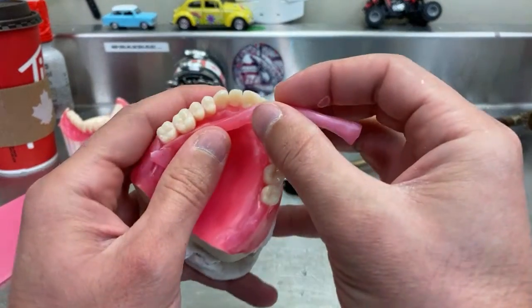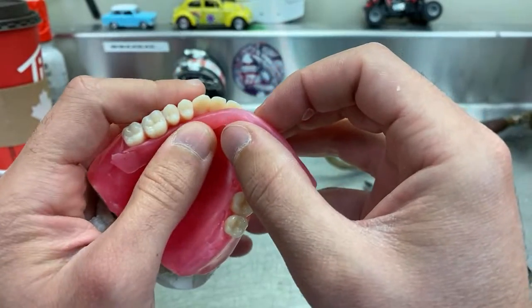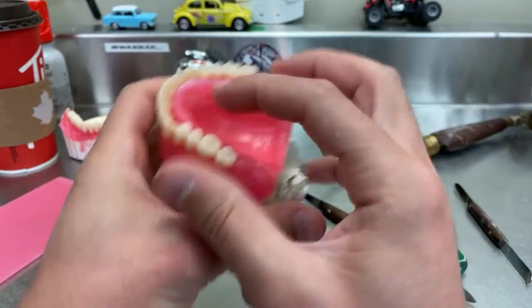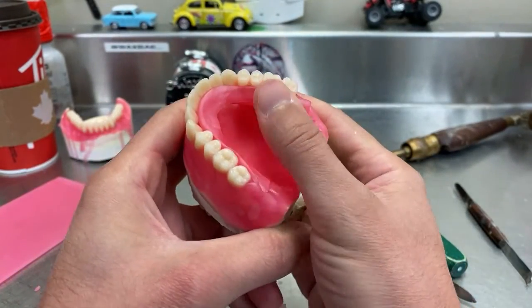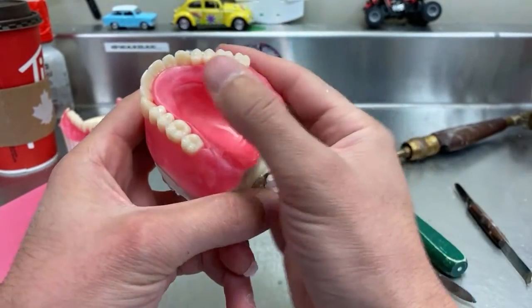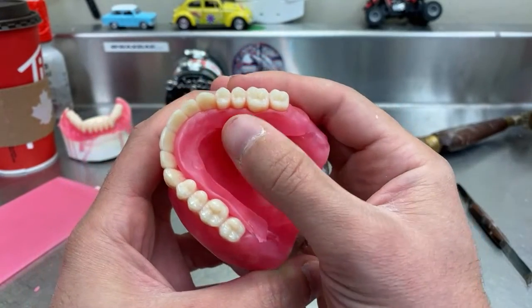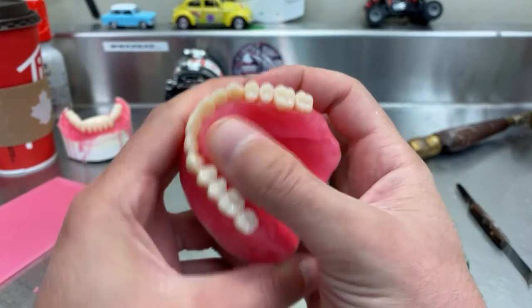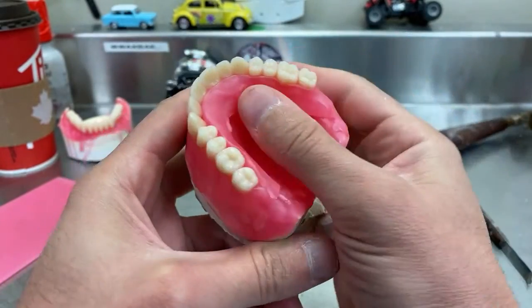See, again, I'm pressing here, not on the teeth. And especially now this side is hot. If you press on those teeth, they're gonna just pop out of the occlusion. And always here. So the center of your pressure is under the teeth. And then the excess you push inside. You can do it any way you want, like it doesn't have to be exactly the same, but this is how I do it to avoid wrecking the bite.